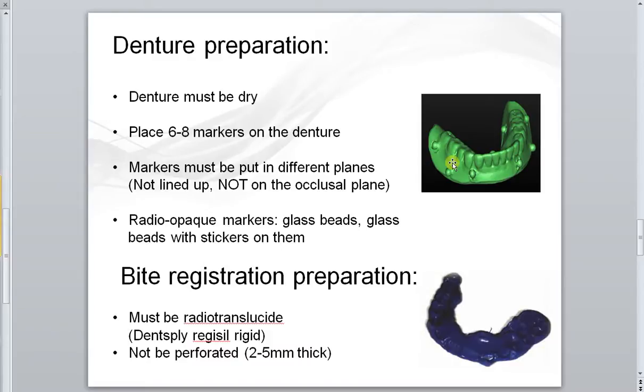And there's a product out there that has the glass beads with stickers on them, so there's no need to modify the denture and put in some gutta percha, or to even just stick those glass beads on with either some wax or additional materials. So there's a great little product out there that you can use.